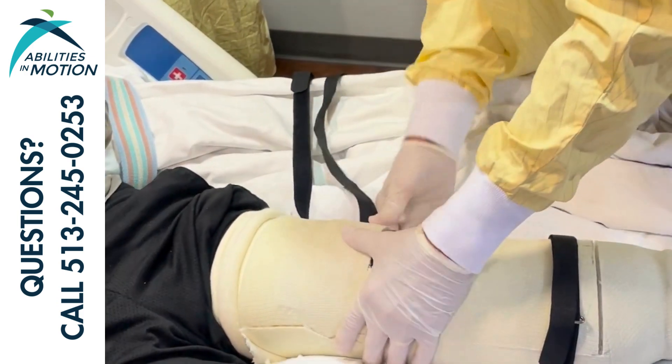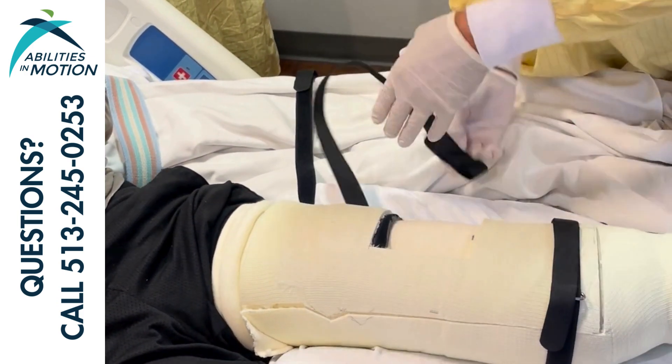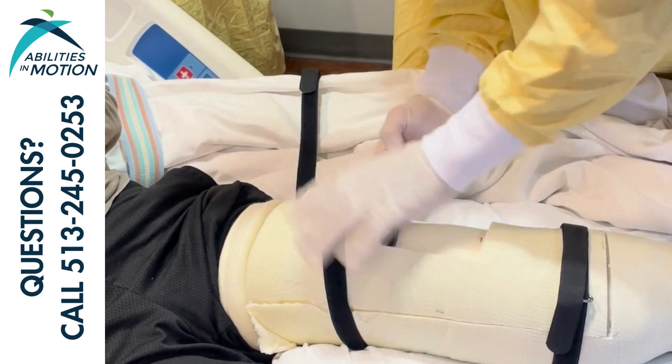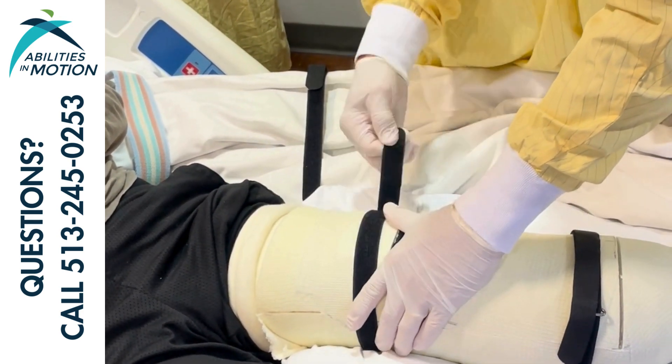Tom is now reapplying the straps to hold the lid of the IPOP in place. Notice as he does that, instead of yanking on the straps, he's tightening them while really pushing down with his hand to compress the lid of the IPOP against the base.